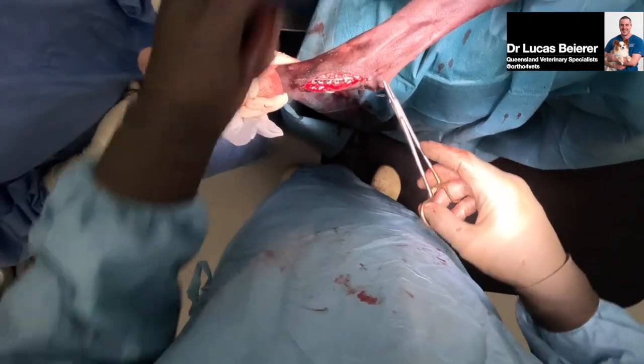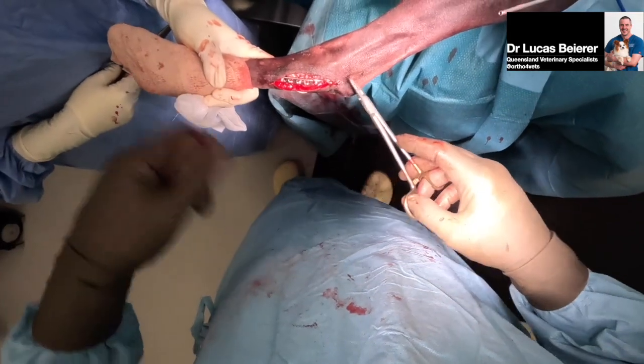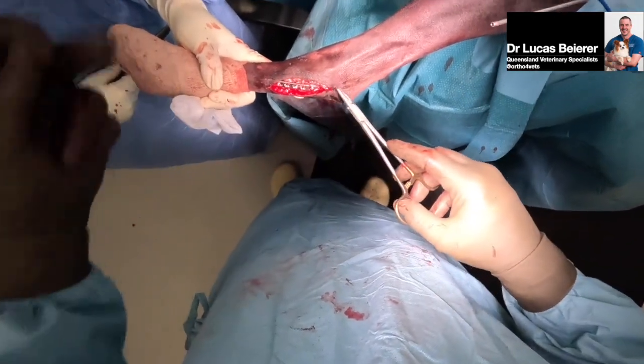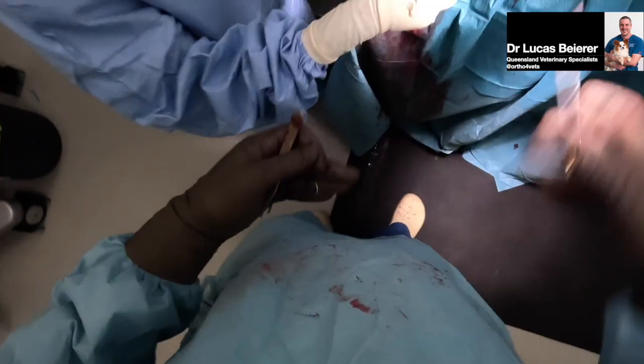And this fracture is a little bit of a choose your own adventure. There's lots of potential ways or methods of repairing it, lots of different implant types. I think this is a pretty dependable way of doing it.